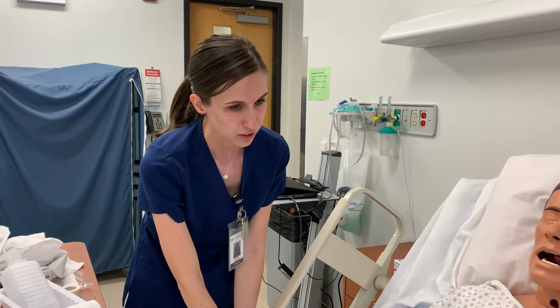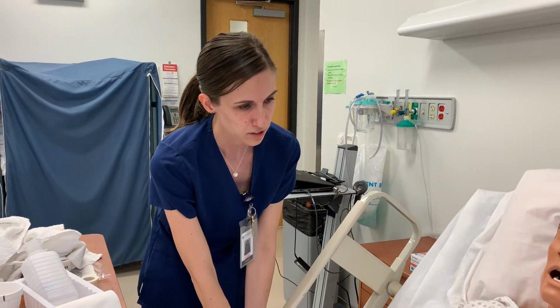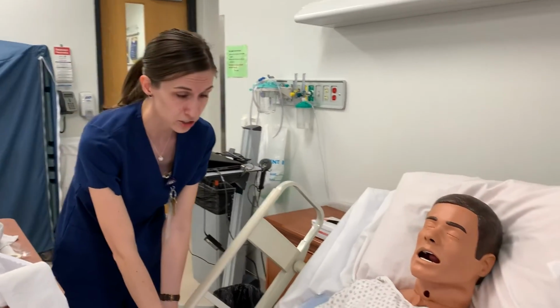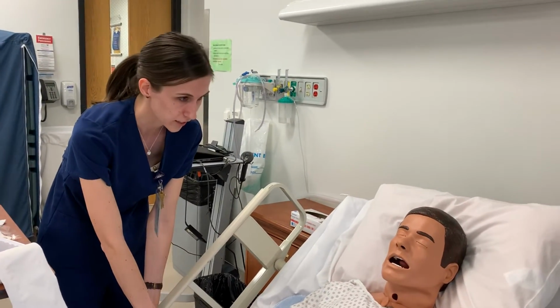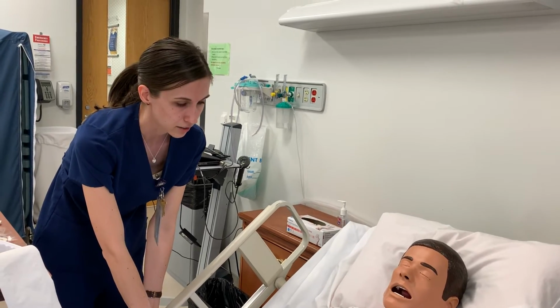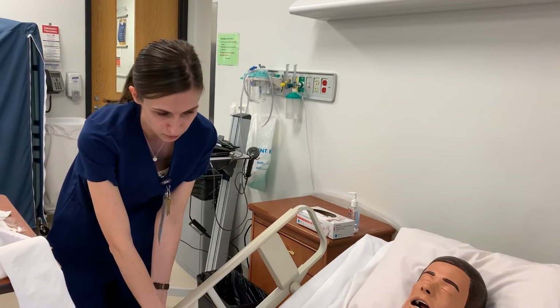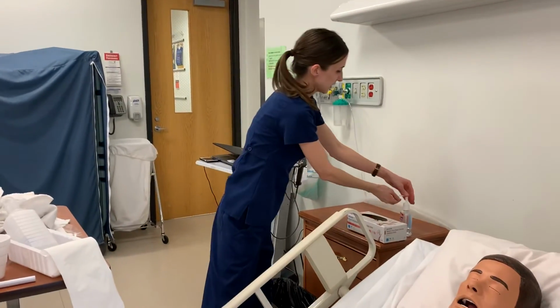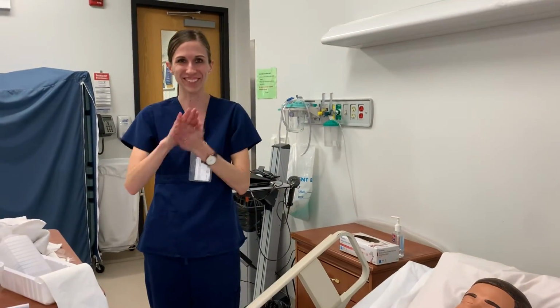I'm going to lower the head back down a little bit for you, maybe to that 30. So again, I'm going to make sure that the bed is in the lowest position, that rails are up if I had put them down at all. The bed is locked, call light is within reach, and then I thank my patient, and then I do my hand hygiene on the way up. Thank you. Pass.